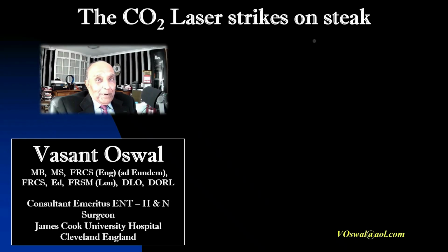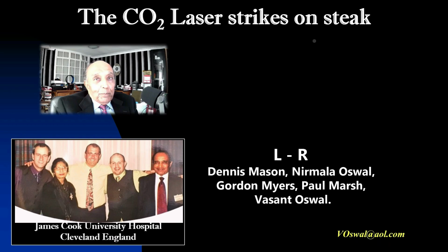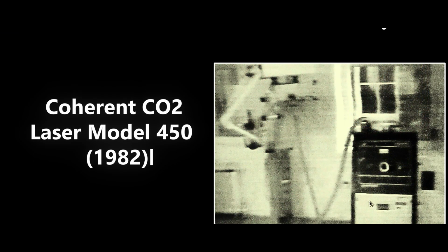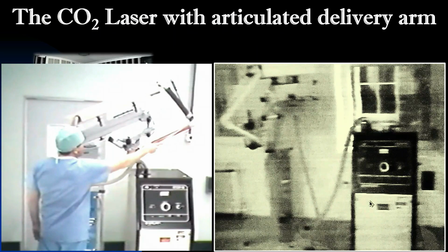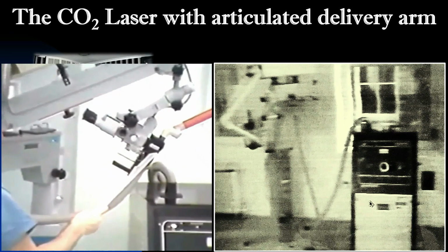After reading a little bit of theory of light, I was now ready to use the laser. I formed a team with the operating technicians of the theater. They were most helpful. They stayed behind after a day's work and we did experimentation in the evening. The carbon dioxide laser needed a constant supply of carbon dioxide gas from a cylinder. The articulated arm delivery enabled us to couple it to the operating microscope, increasing its mobility and delivery tremendously.